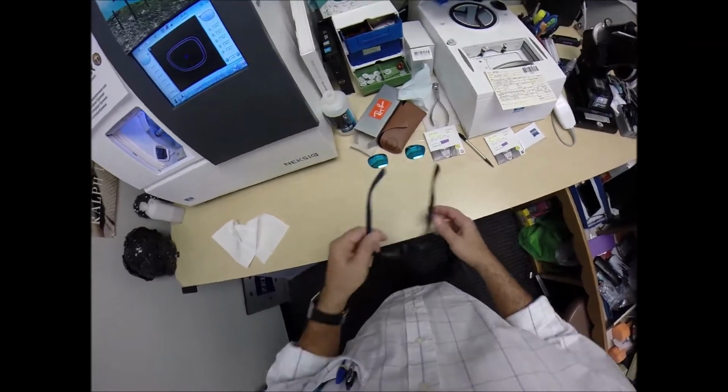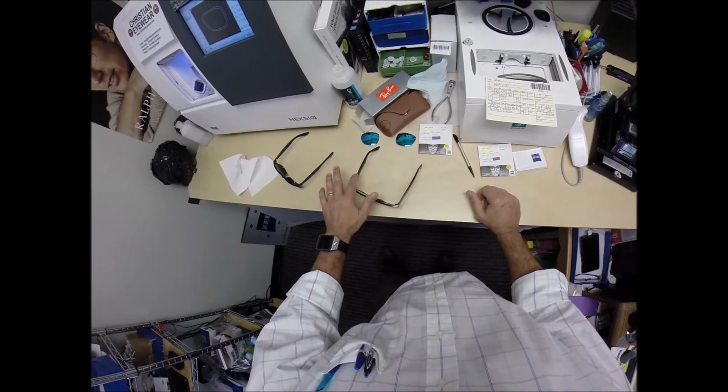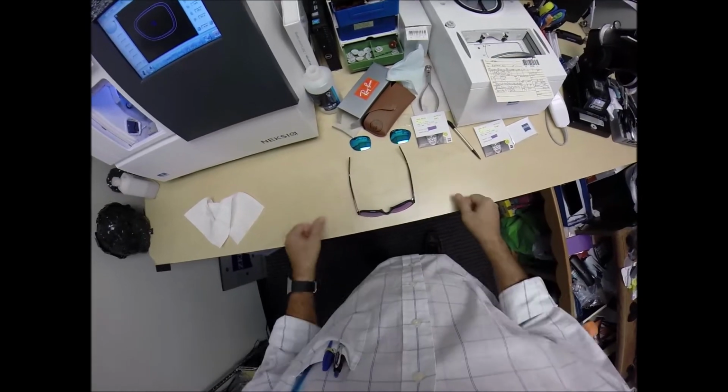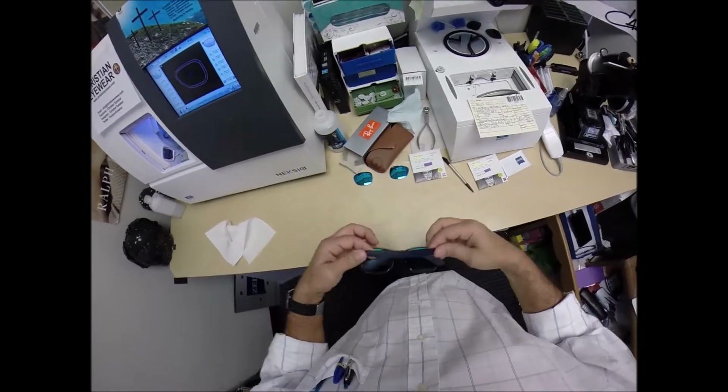There is no wobble. Now, when I say wobble, I take mine off and press down. They wobble on the counter, but they sit level on me. Put mine back on so I can see what I'm doing. Flip this over, press down to make sure there is no wobble. Close each temple to make sure they overlap perfectly, and they do.